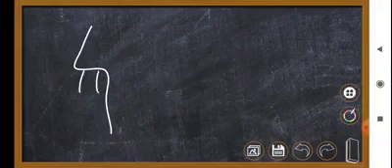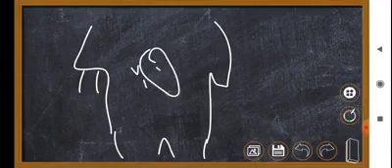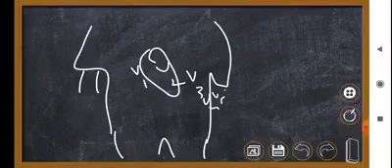And everyone knows, suppose this is a person and this is his heart, and lead 1 is attached somewhere here, lead 2 here, V2, then V3, then V4, then V5 and V6. Everyone knows that. So what actually happens is, I'm going to discuss where these leads look at the heart and from which angle.